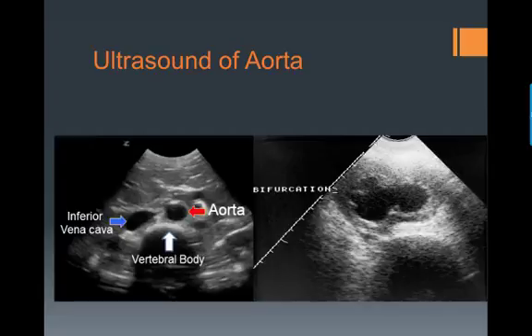A lot of the times the aorta will be pulsatile, and next to it on the left will be your inferior vena cava. In its most proximal location, it may have kind of a double pulsatile look as it's getting reverberations from the heart and the aorta next to it.